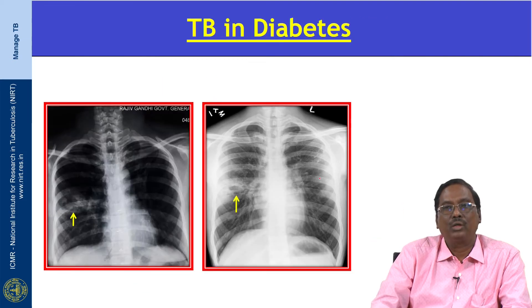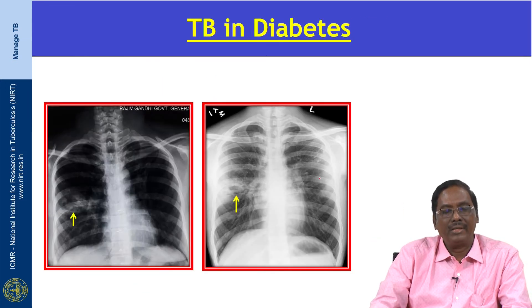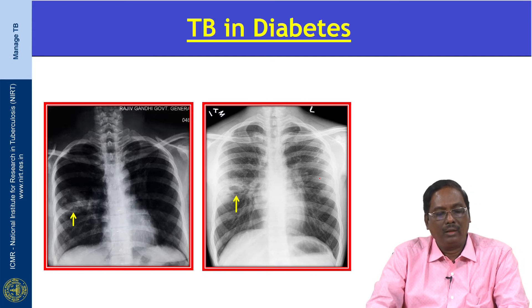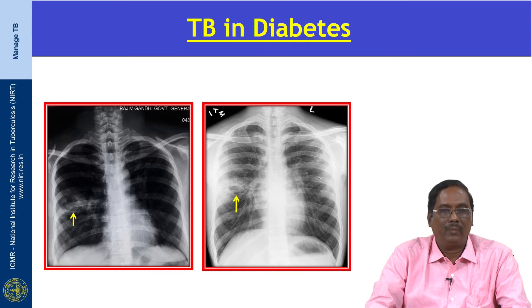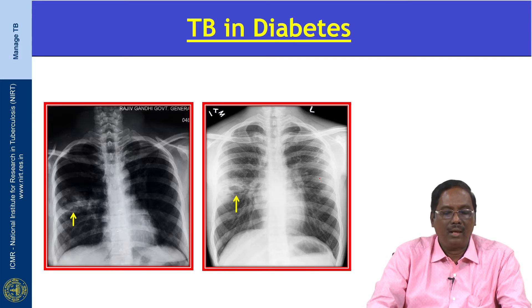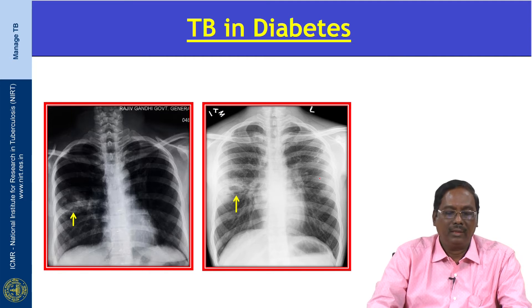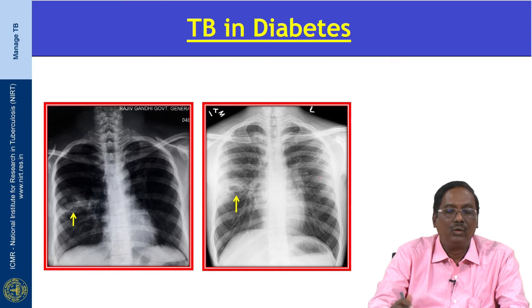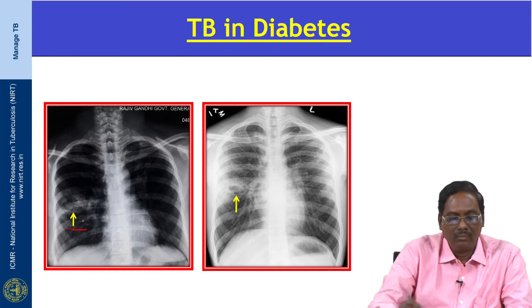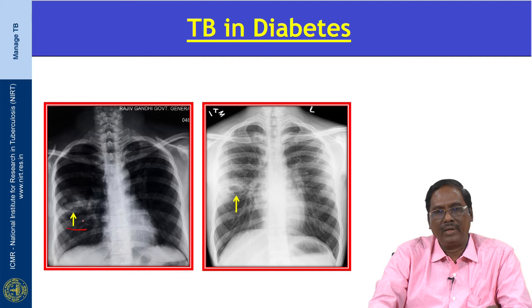This x-ray shows tuberculosis in diabetes. Diabetes is estimated to cause 15 percent of present tuberculosis cases. Patients with diabetes have a fourfold increased risk of developing TB, with increased risk of failure, relapse, or delayed sputum conversion. The radiological presentation usually involves the lower lung field, with the most important pattern being cavitation.